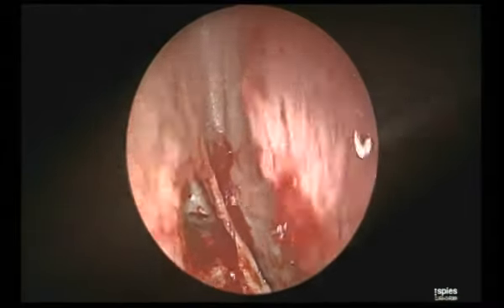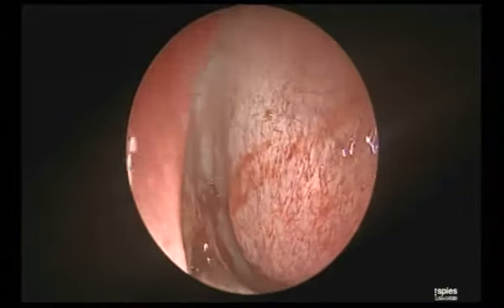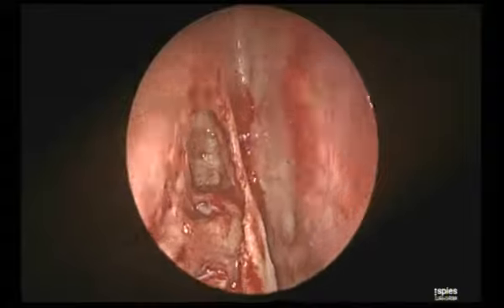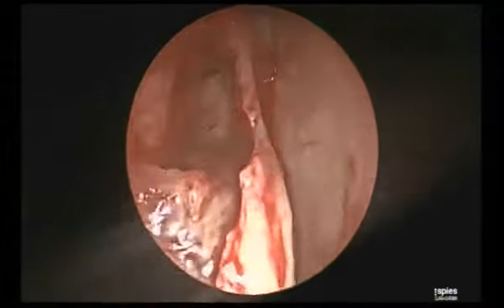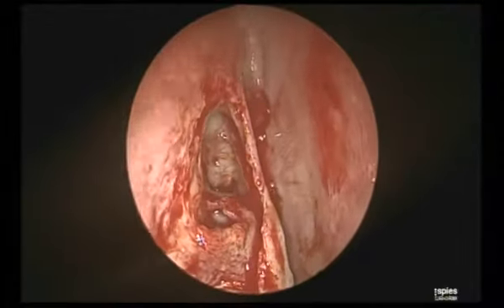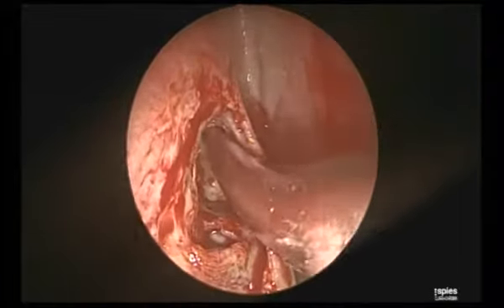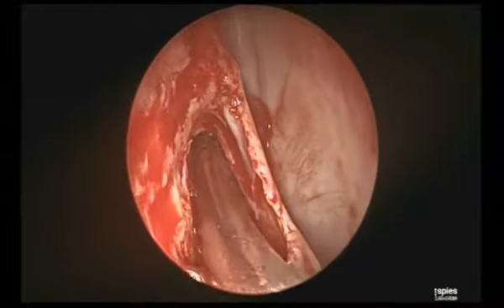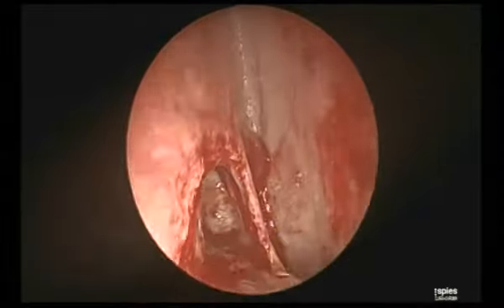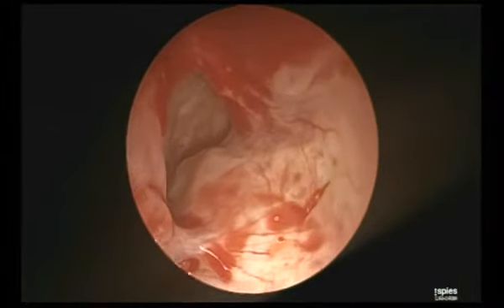No other telescope can give this much visualization of the limits throughout. Visualization of what? Not just frontal limits. Now see, with this is my bulla below, the lateral limit, the medial limit, and once I see all this, just go on to the beak. See this beak? I will flush the beak, go behind, and go into the frontal above. Can you see very clearly? Everything so clear. Fantastic. Not 1 millimeter of mucosa damage, in three quarters of its circle.